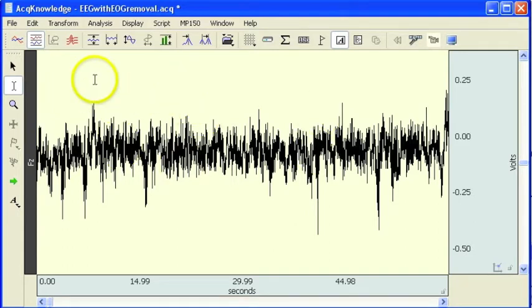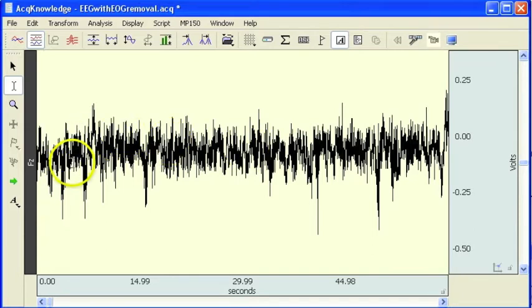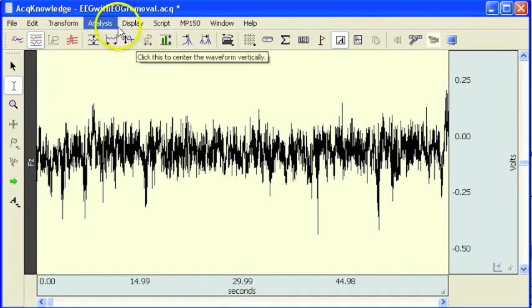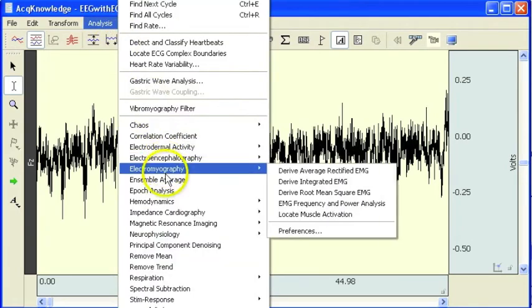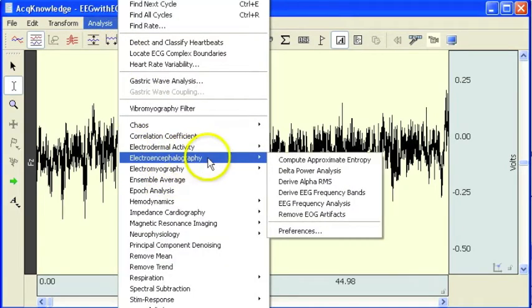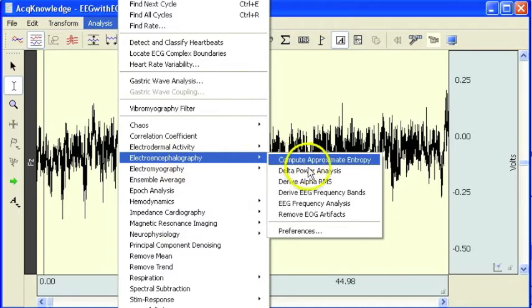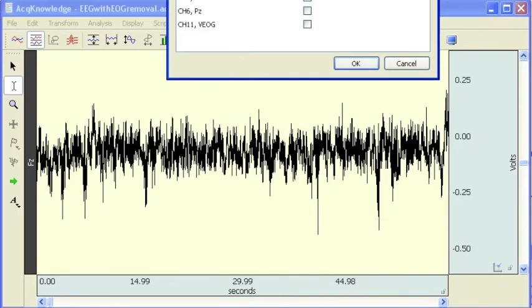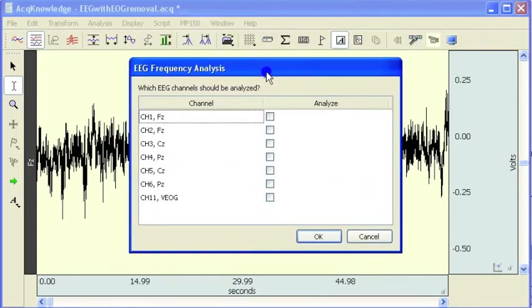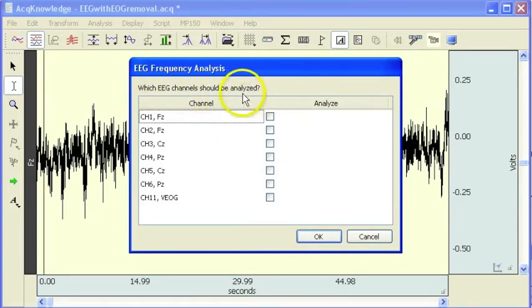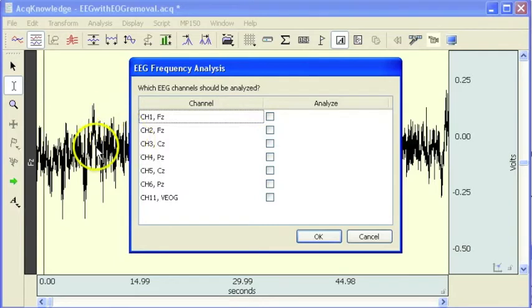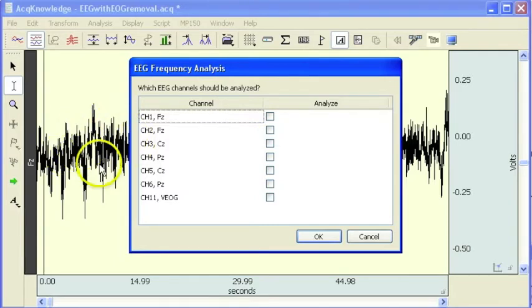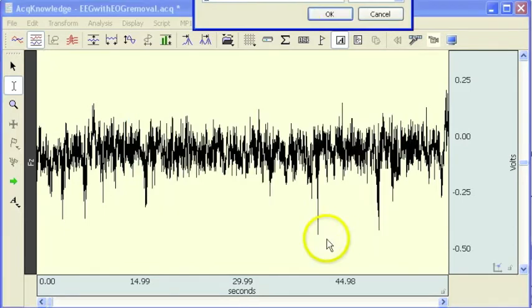Here we have a raw EEG waveform, this is FZ, and we are going to go into the EEG menu, select EEG frequency analysis, and choose which channel to be analyzed. There are more channels in this file than what are being displayed in the graph. So if I select FZ, hit OK.